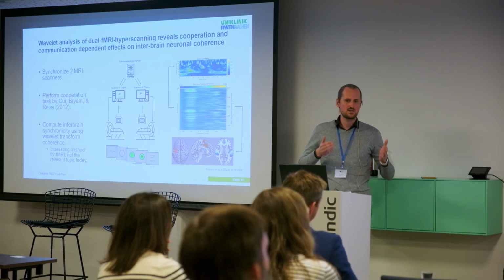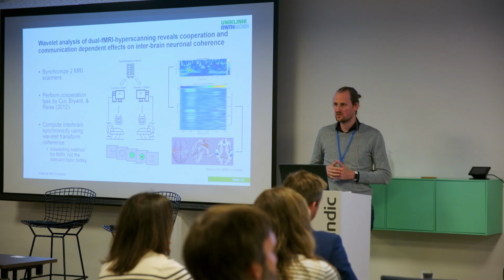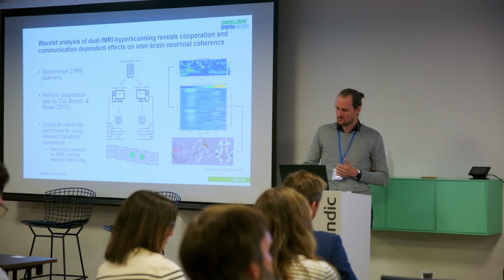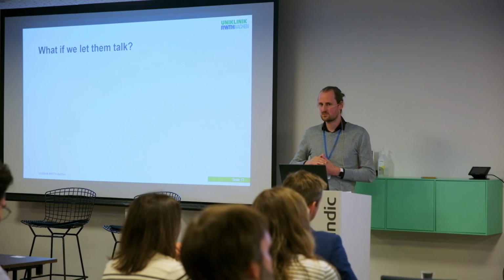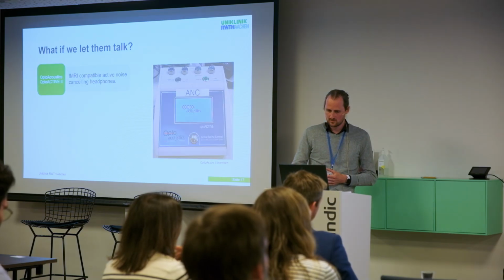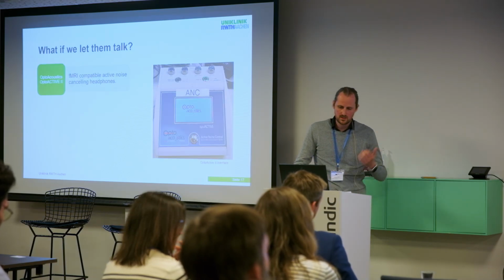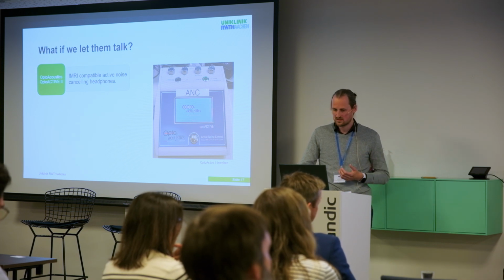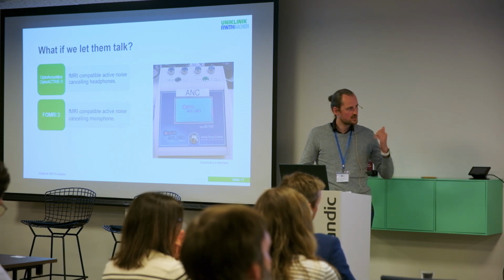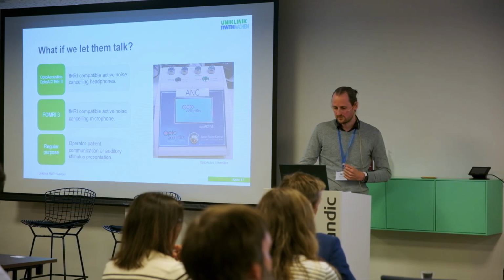So as I mentioned, the participants in the original task could not communicate with each other. So we asked ourselves the question, what if they could? What if we let the participants talk with each other? So how do we do this? In our case, the OptoAcoustics OptoActive 2, it's noise cancelling headphones combined with a noise cancelling microphone.